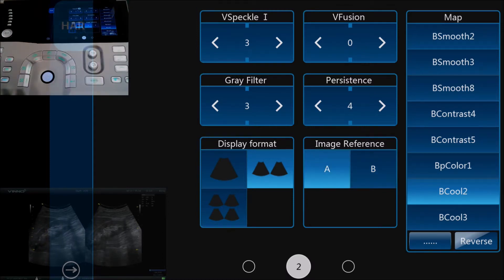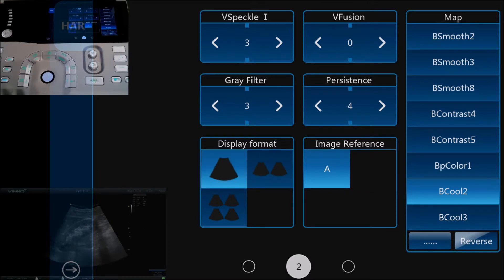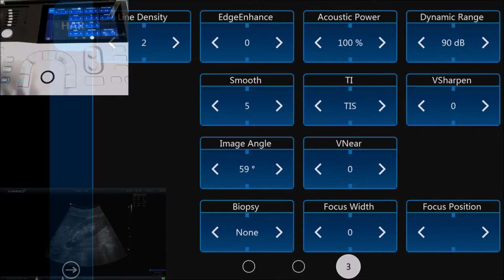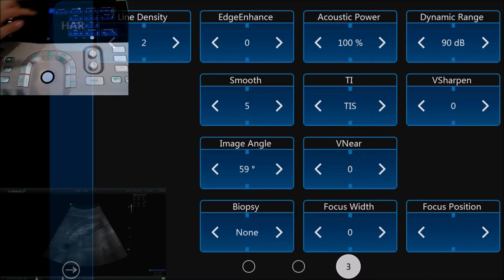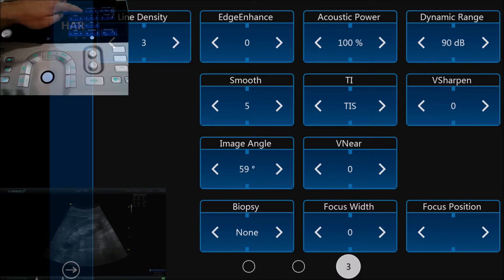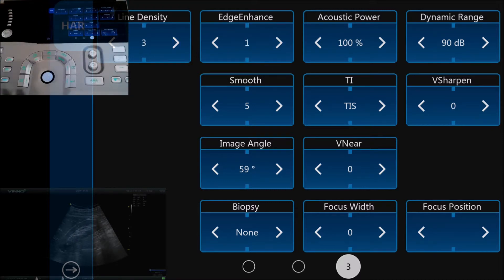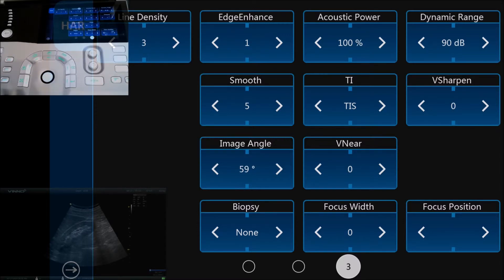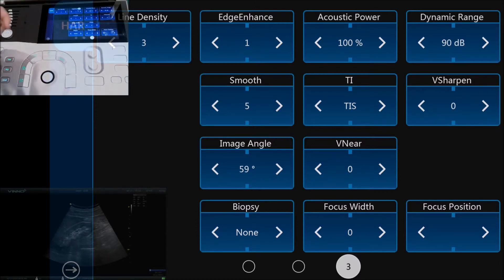Sliding across one more, we have even more image parameters. We can increase the line density, we can change the edge enhancement if we want to make the edges stand out a little bit more. We can change the acoustic power or the smoothness of the image, so there's a lot of different things in here that you can change to optimize the image to your own liking.